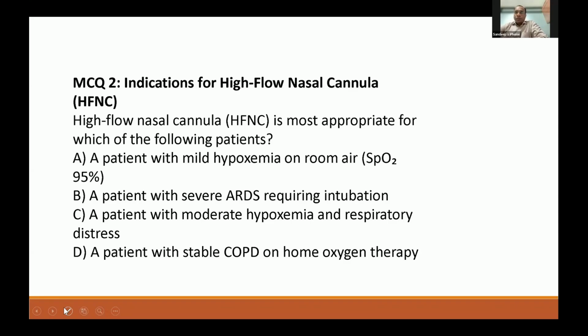Next, please. Yeah, so next time when you go and see how the high flow nasal cannula looks like, this is basically just a device, just like how you give the NIV, non-invasive ventilation. It is a similar device, but there is a nasal cannula and there is a circuit through which you can give a very high flow oxygen up to a flow of 60 liters.